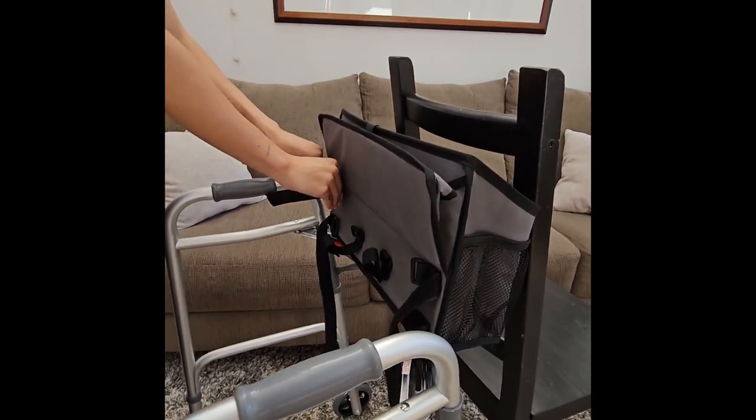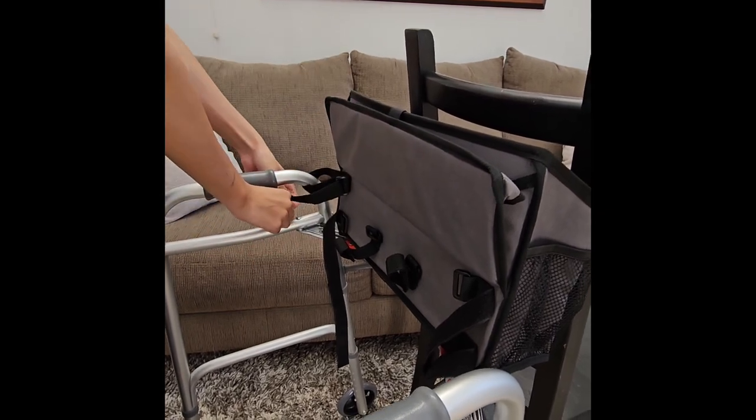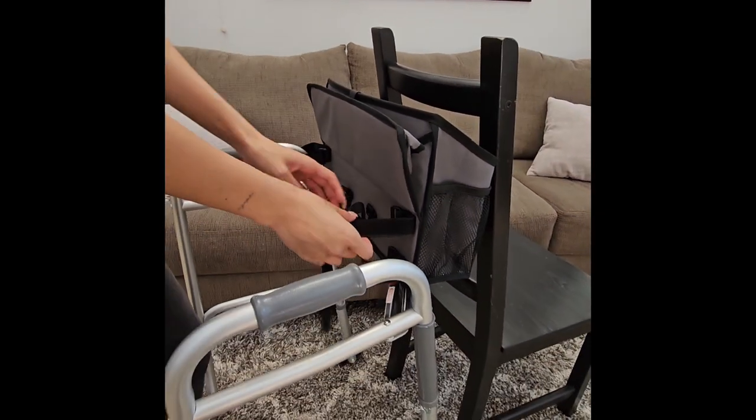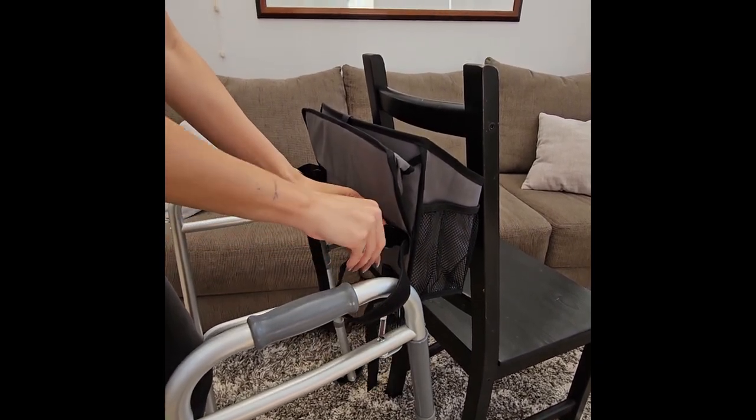Loosely attach the upper left strap by bringing the strap around the outside of the walker, through the buckle, and fasten the strap loosely. Repeat this step with the upper right strap.